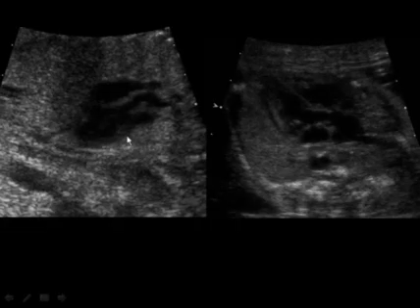One thing I do want to clarify is that the plane of imaging for the aorta is key. This image is taken in the sagittal plane, and I know it's sagittal because I can see the diaphragm here and the liver, and I can see the lungs, and I can see the ribs. This is the lower portion, or the inferior aspect, of the heart. This is the anterior wall of the heart along the sternum, and so that makes this the anterior wall of the aorta, and the posterior wall of the aorta. And then this is the entire left ventricle.